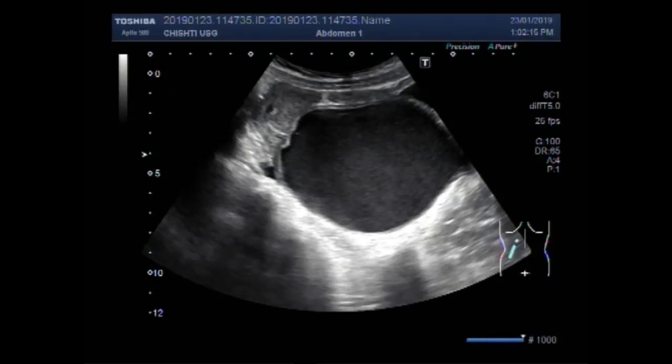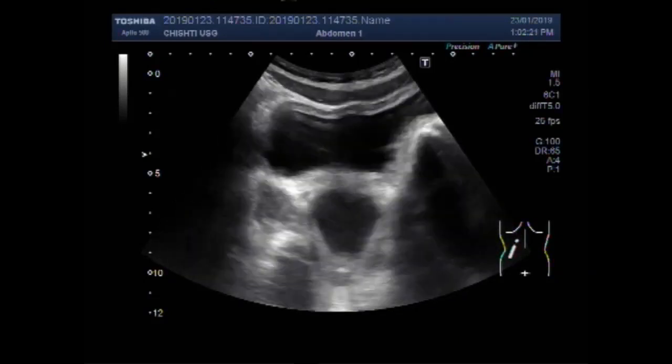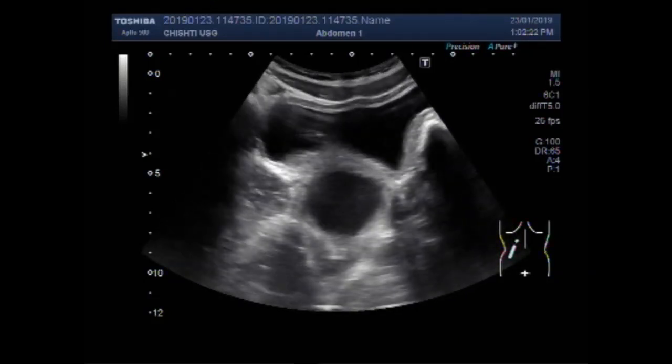Dear viewers, I hope you are all fine. This ultrasound video shows a case of hematocolpos.